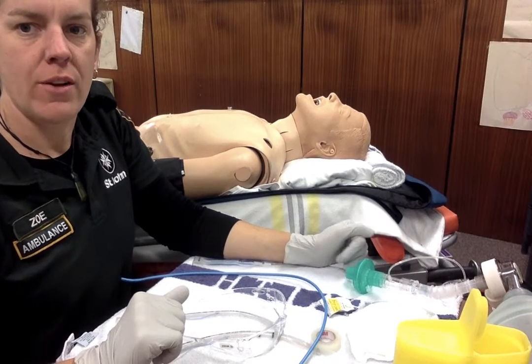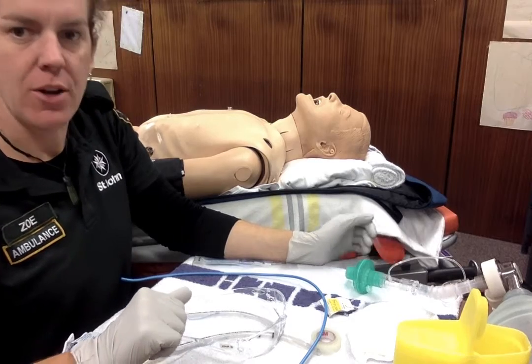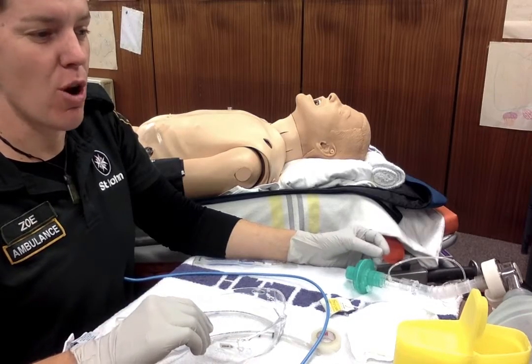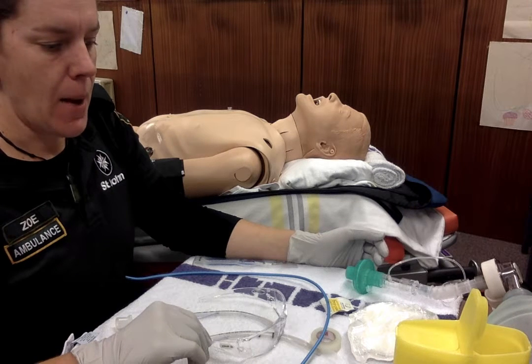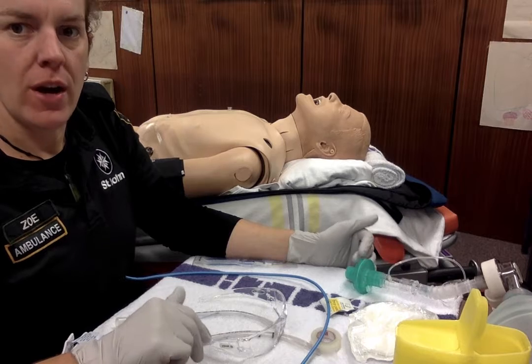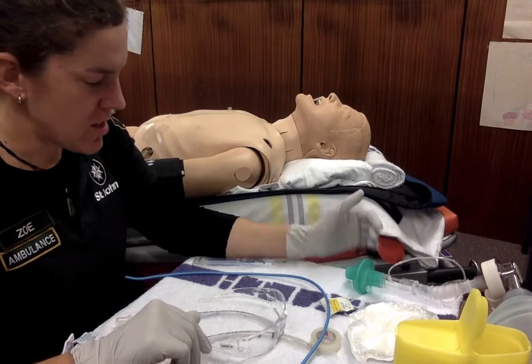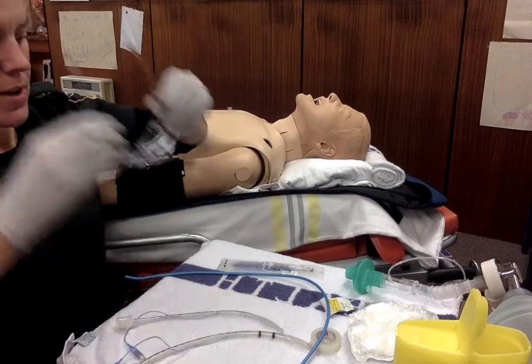A surgical cricothyroidotomy is indicated for the patient that you cannot intubate and you cannot oxygenate. Examples of that would be a foreign body airway obstruction, obstruction from trauma or swelling such as anaphylaxis, a difficult airway that you've had a failed intubation for and you cannot oxygenate in any other way. So it's kind of your last ditch effort to get oxygen into this patient. It needs to be done reasonably quickly, but you've got to get a few things ready first.